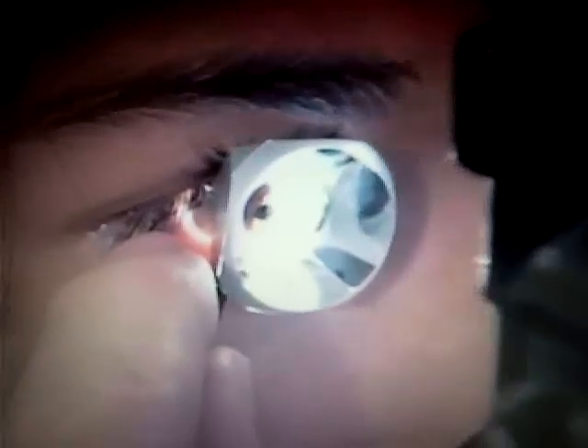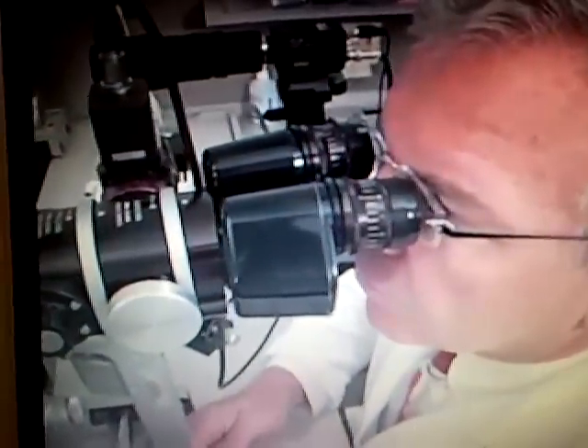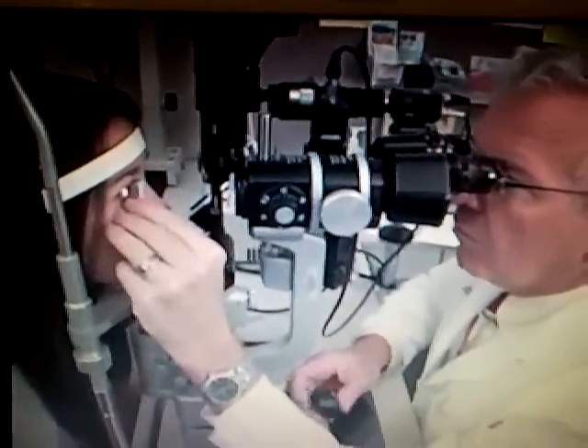This lens is held between the thumb and index finger. The remaining fingers are used to brace the hand against the patient's cheek. This will steady the hand and allow the examiner to keep up with any small movements. The lens is held lightly — this is one of the hardest aspects of this kind of lens. When performing gonioscopy with a four-mirror lens, there is constantly air going in and out underneath the lens, letting me know that I am not pushing too hard.